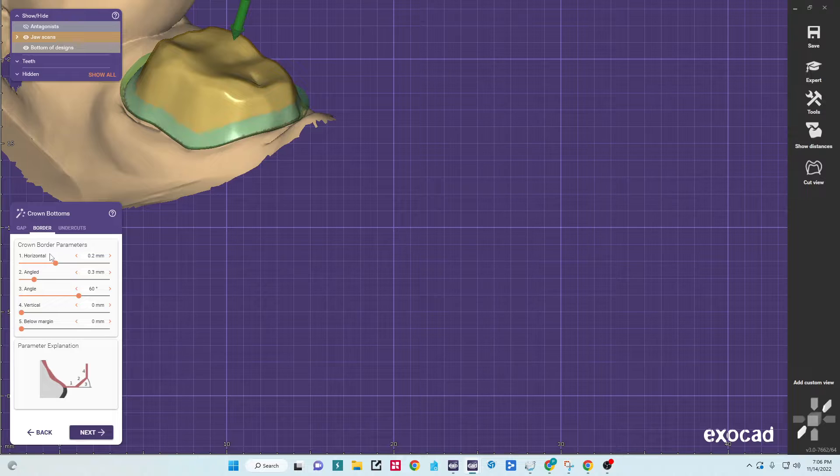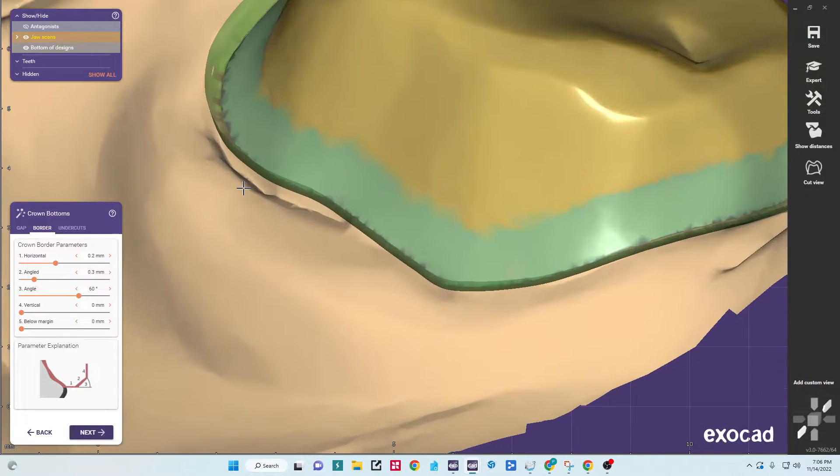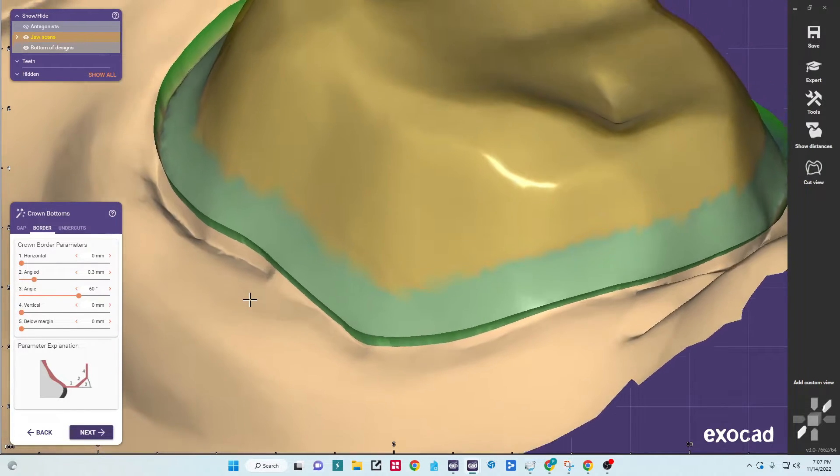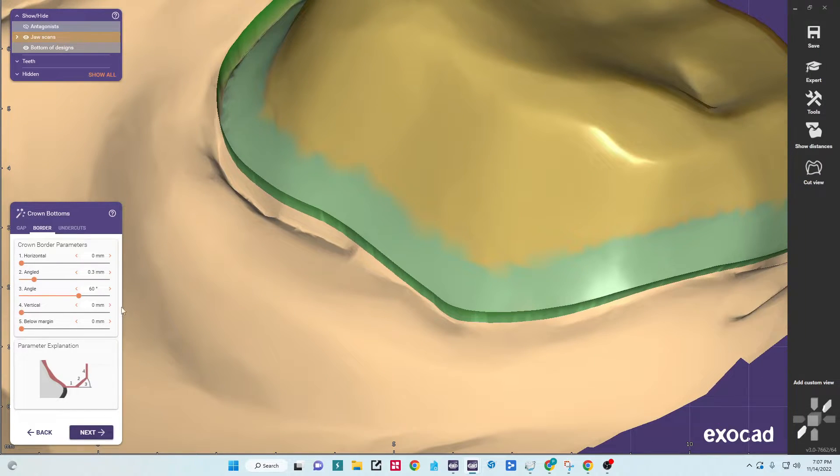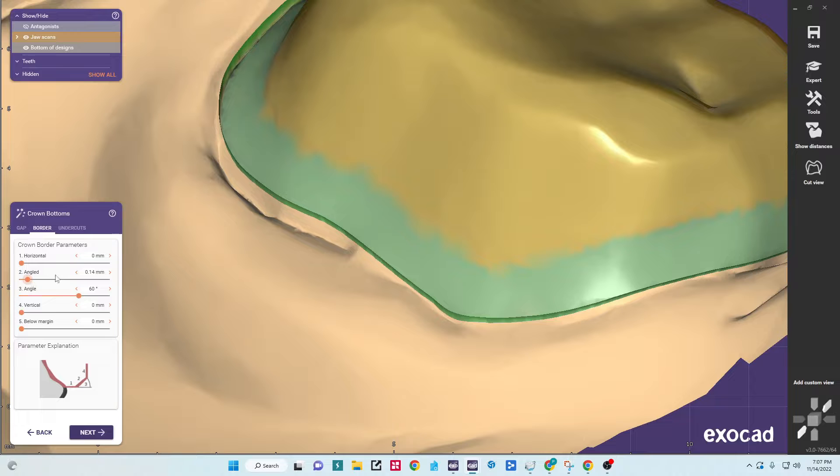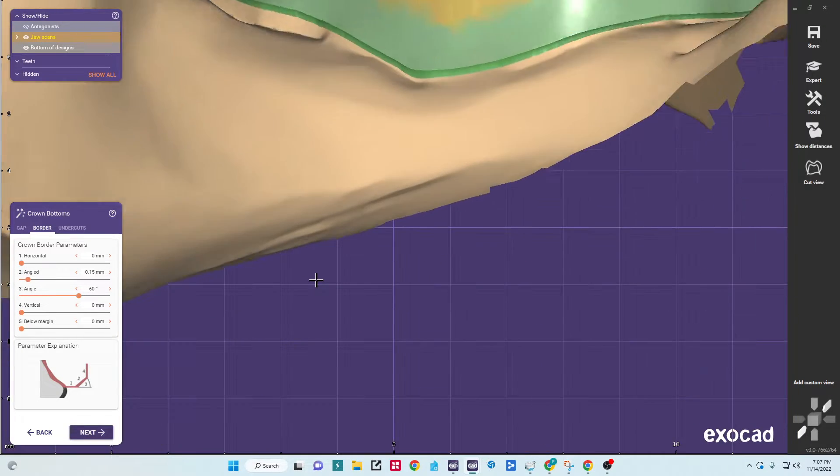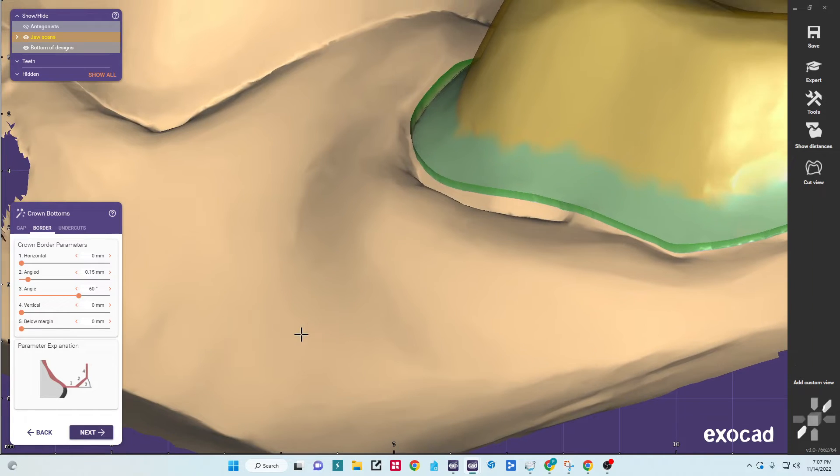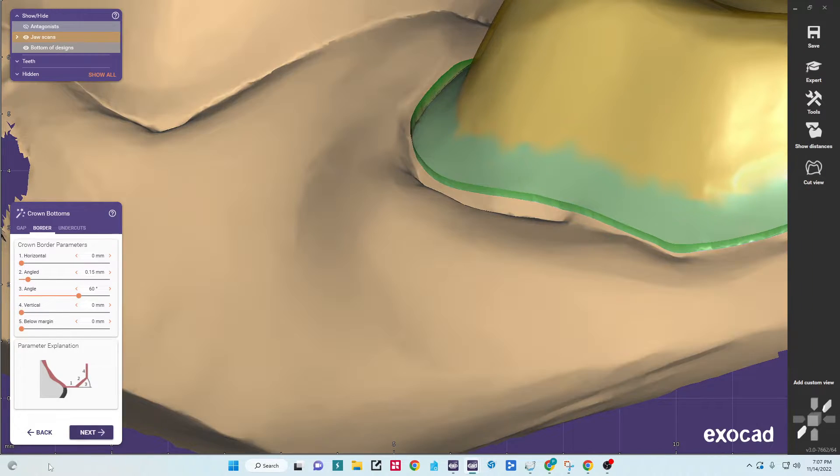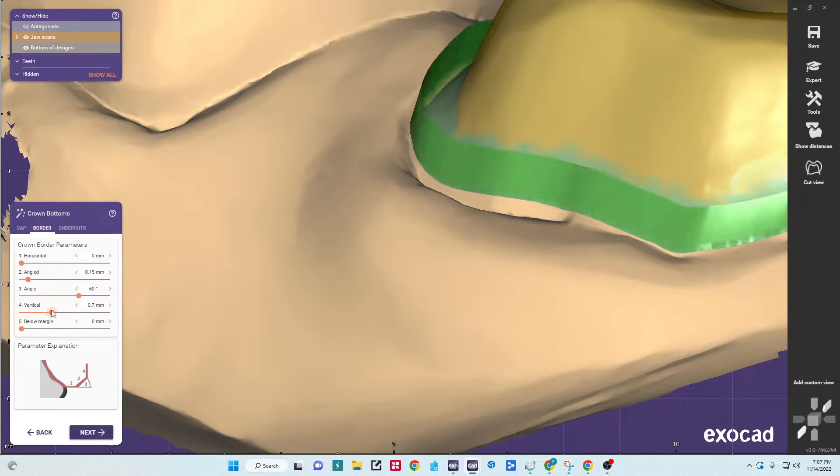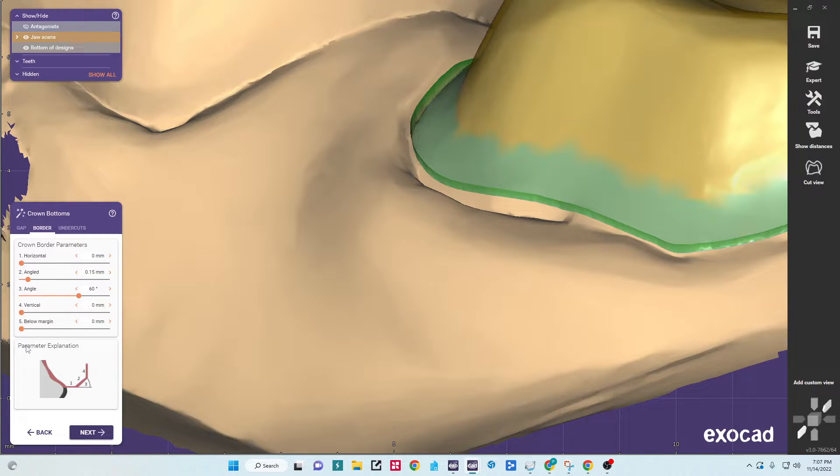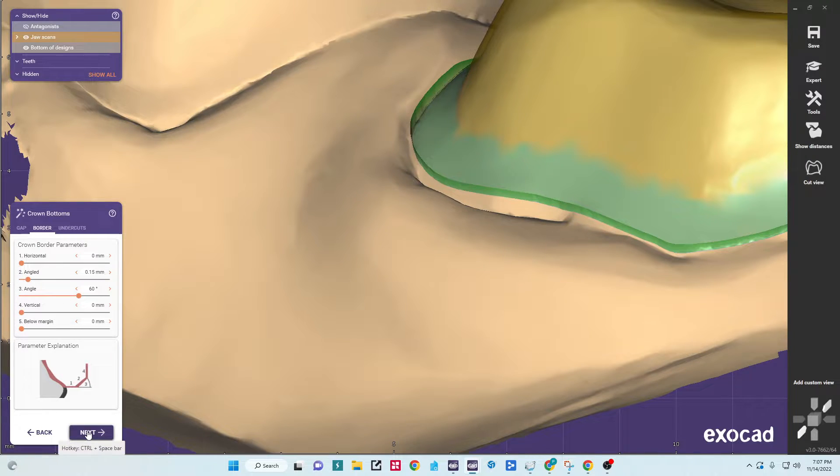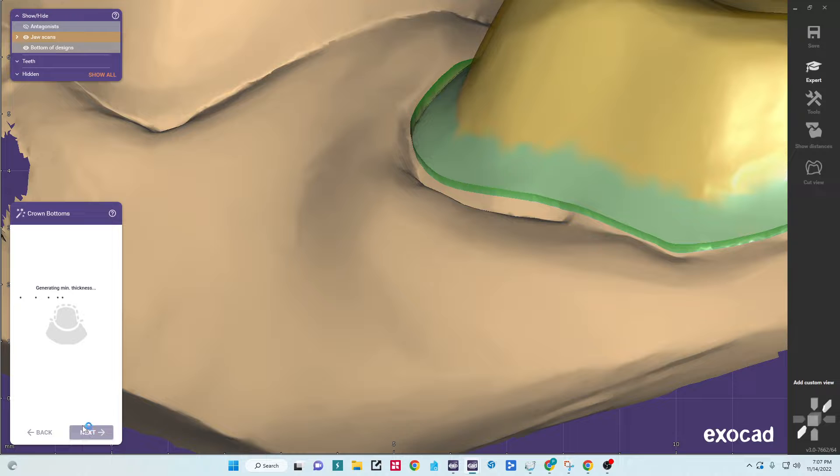And then on my border, the border is this little green line. I want to reduce the horizontal all the way down. That's a thickness that it adds for milling. And then I'm going to change my angle to 0.15. What that does is put just a little shoulder that's pretty anatomically shaped that comes off of the margin. The vertical would add a component here to the height. I don't want to do that because it'll make the crown shape funny. And then below margin will actually drop your margin down lower, which we don't want to do either. So we'll go to next.